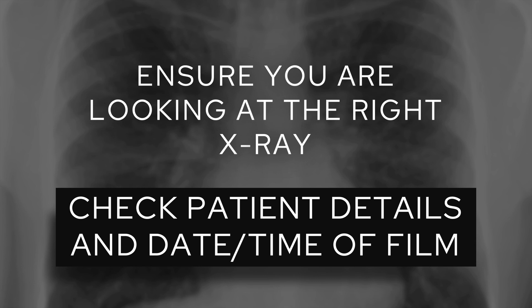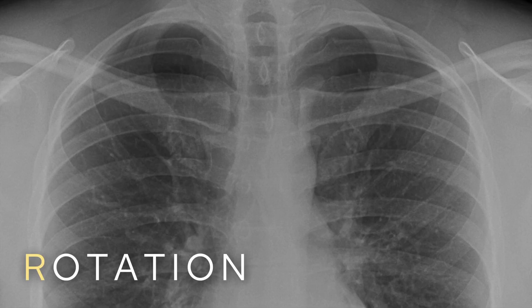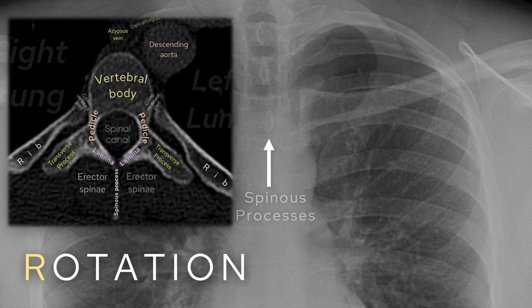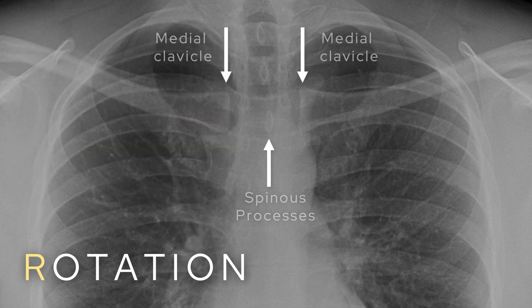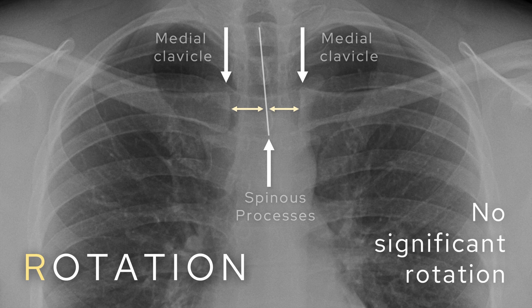Once I've confirmed I have the right X-ray, I move on to a mnemonic — RIPE C — which takes me through each part of the assessment systematically. The first letter is R for rotation. You want to find the spinous processes. A spinous process is a posterior projection from the vertebra — it's where the laminae join up, and you can see this pretty well on a chest X-ray. Then find the medial clavicles, draw a line through the spinous processes, and see if that line lies in the middle of the medial clavicles.